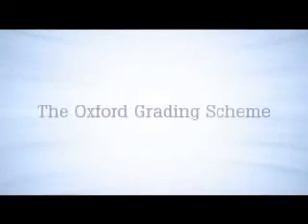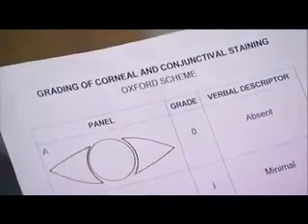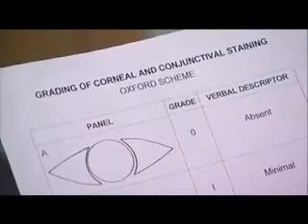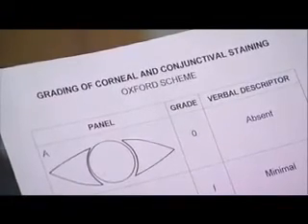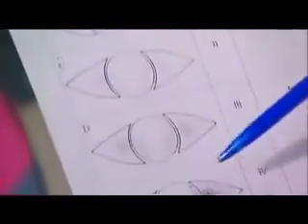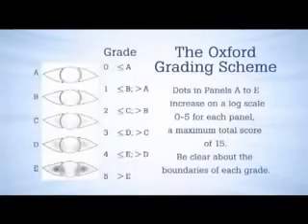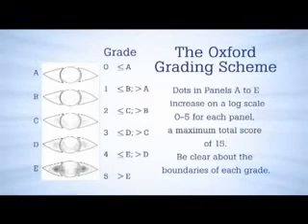The Oxford Grading Scheme. In the Oxford grading scheme, staining is represented by punctate dots on a series of panels, A through E, with the dots increasing, ordered on a log scale. Staining ranges from 0 to 5 for each panel, giving a maximum score of 15 for the total exposed conjunctiva and cornea. It is important for the observer to be clear about the boundaries of each grade.